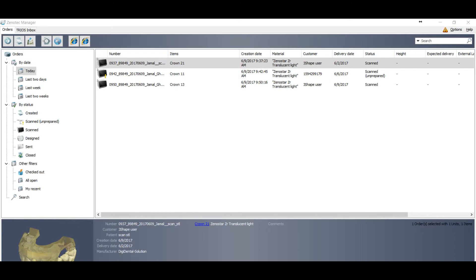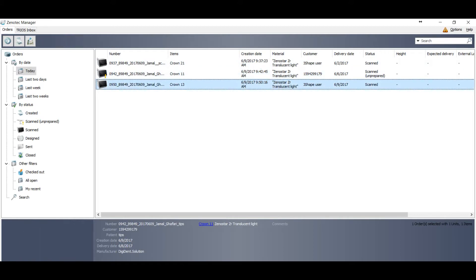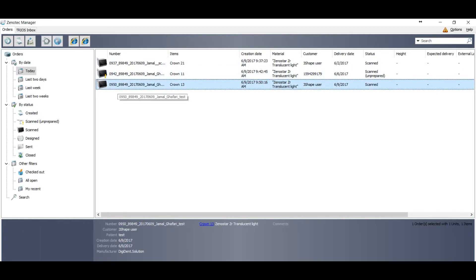So we have here three types of orders: one simple order without anything, then there is an order with yellow mark, and then we have one order that is with the preparation scan. So this order has three files.